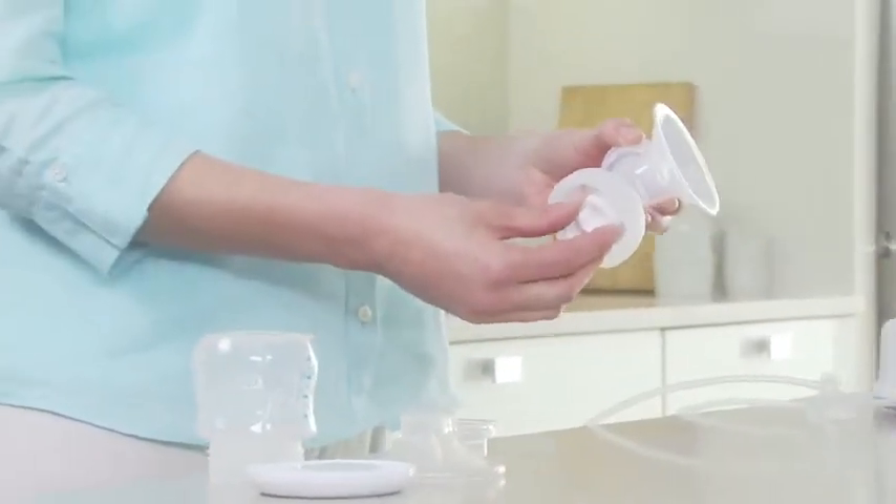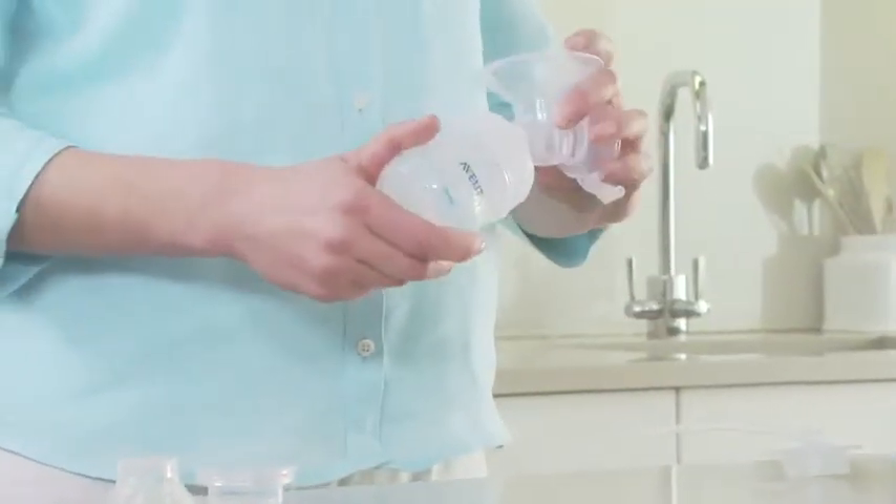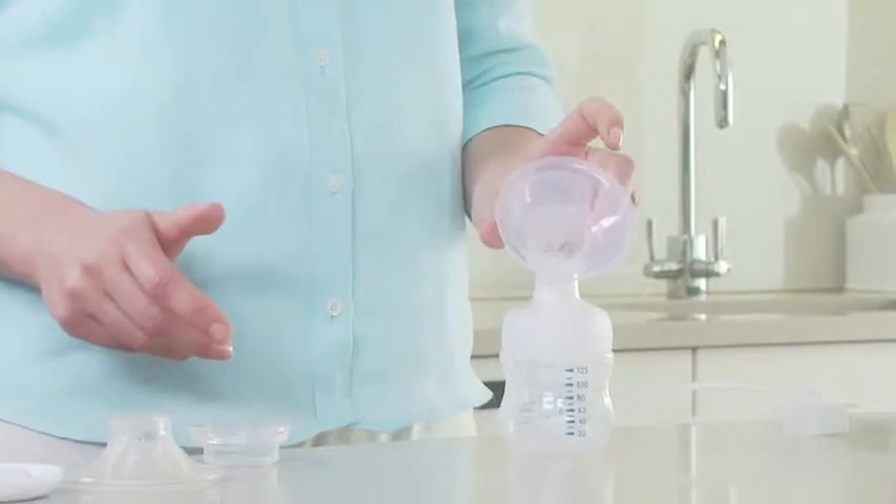Insert the white valve into the pump body from underneath and push it in as far as possible. Screw the pump body onto the Philips Avent natural bottle until it is securely fixed.